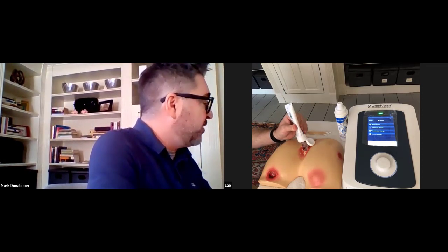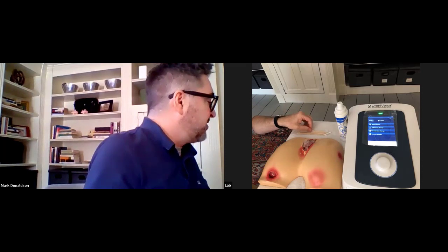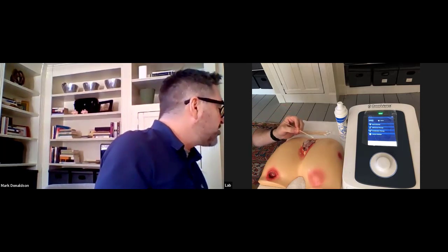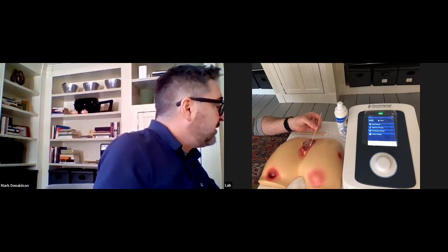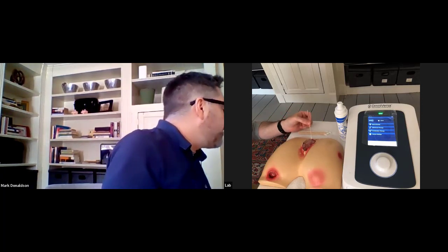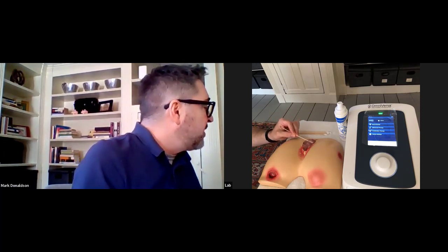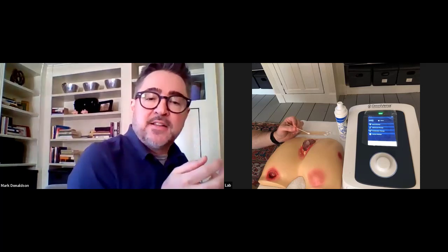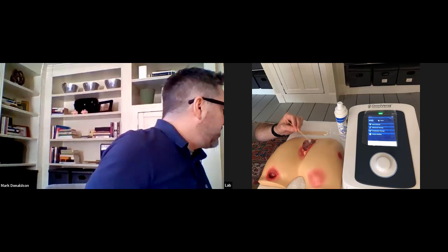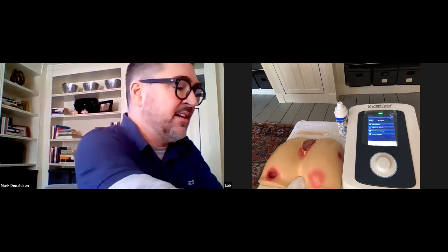When I say fill the wound, I mean fill the wound. I tend to overfill it a little bit primarily because we want to make sure we're capturing all the little pocket areas where we want the gel to go. Remember, ultrasound is not going to travel through air, so if we have any air pockets within here, we want to make sure they're completely full. Also, if the patient changes position, that can create a little shifting of the gel, so I tend to overfill it slightly.